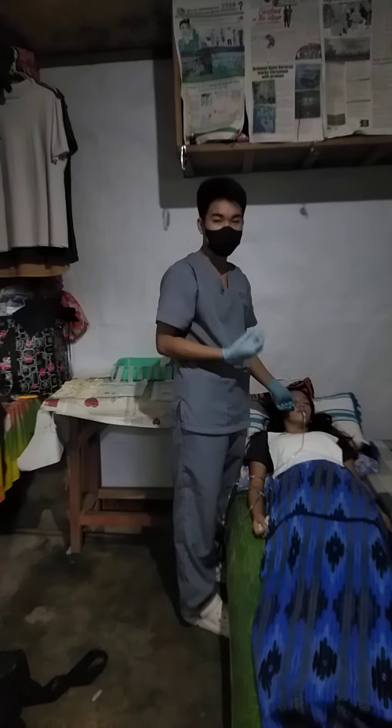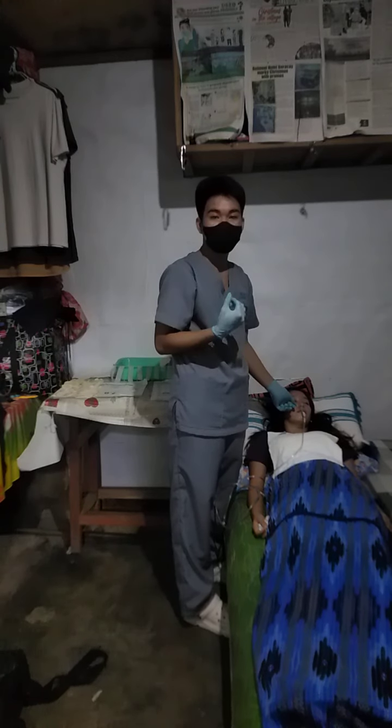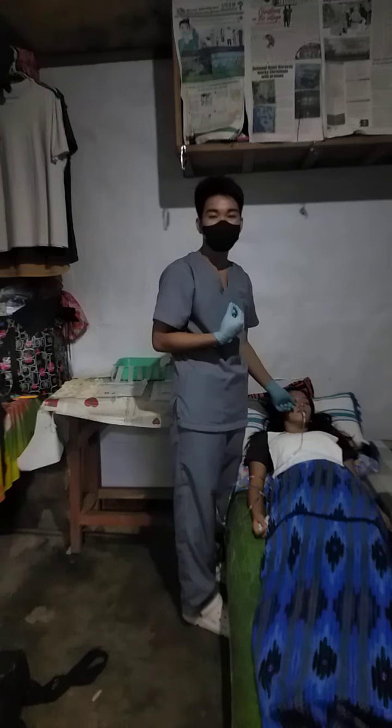Then secure the tube loosely to the patient's nose or cheek until it is determined that the tube is in the patient's stomach. Securing with tape stabilizes the tube while position is being determined.